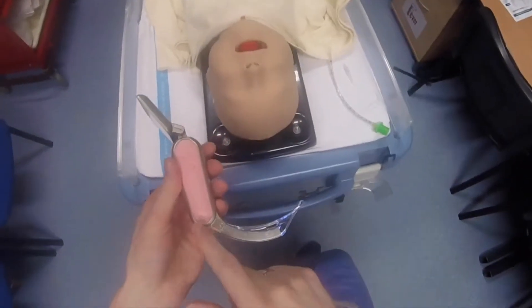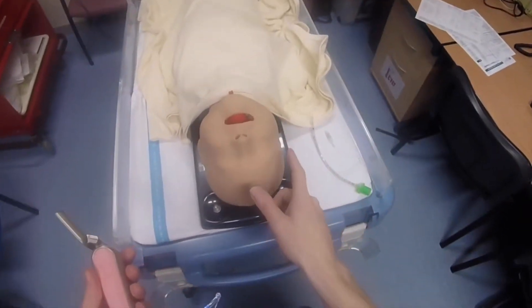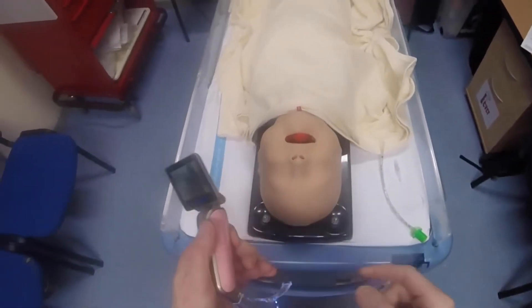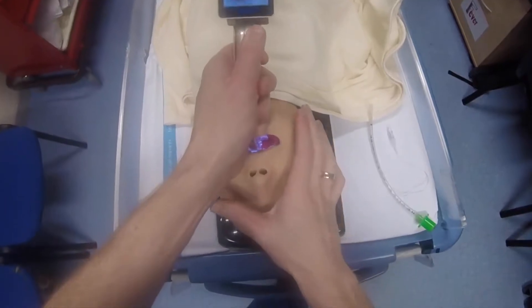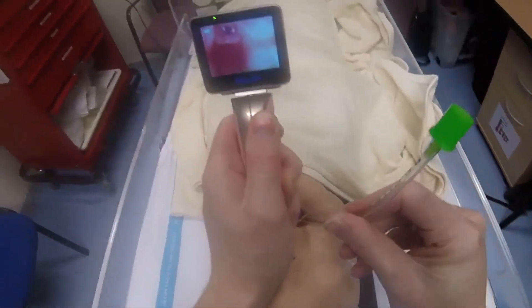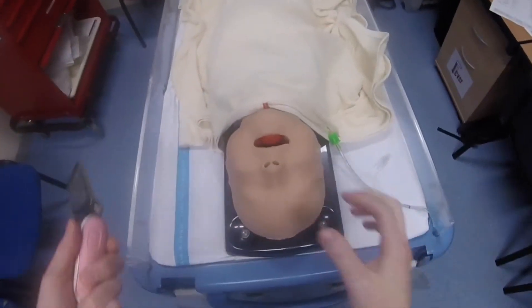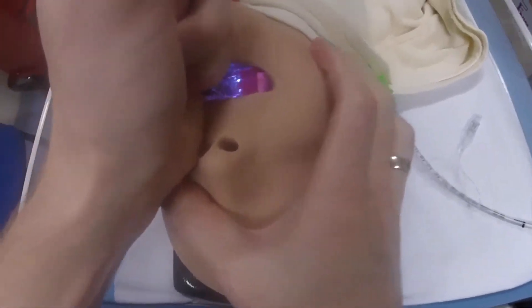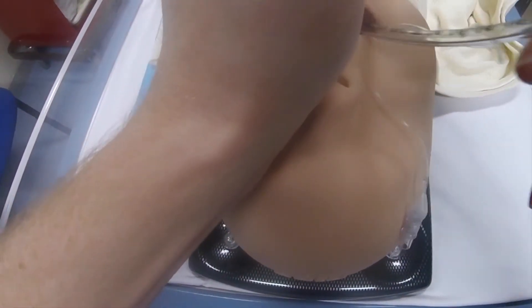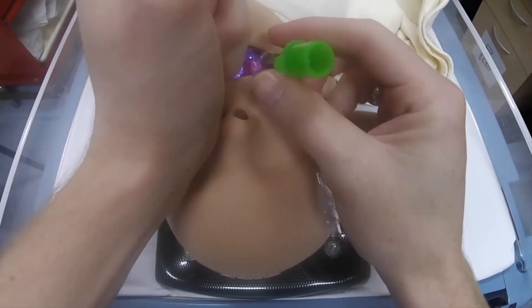I've got the paediatric Medan loaded with the small blade, which is the equivalent of the Mach 2, and I've got the child airway model. I'm also going to have another go using direct vision — not looking at the screen — and it's still possible to do the intubation well.